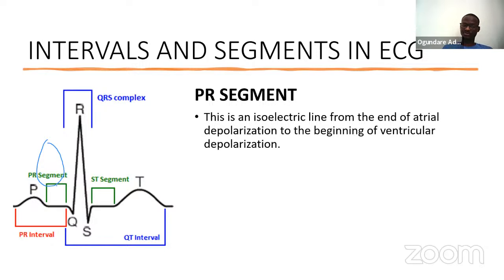When the PR segment is depressed, it suggests pericarditis, if it comes alongside a widespread ST elevation. Well, I will come to ST elevation later. Streamlining you to the PR segments.